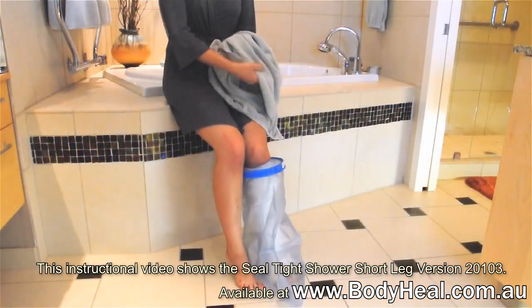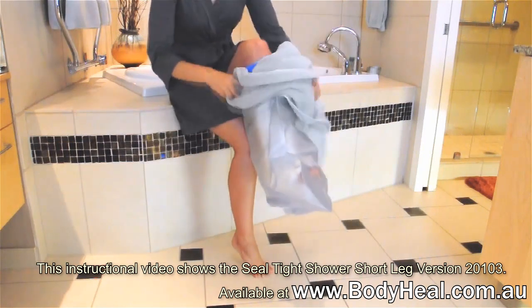Removal is easy. Just dry the protector thoroughly before stretching the seal over the cast.